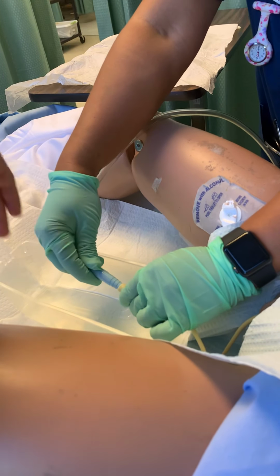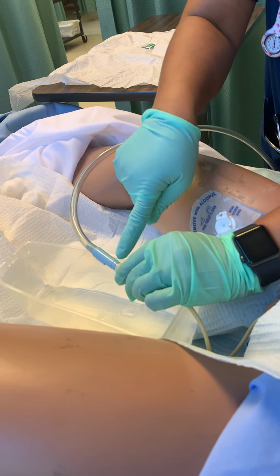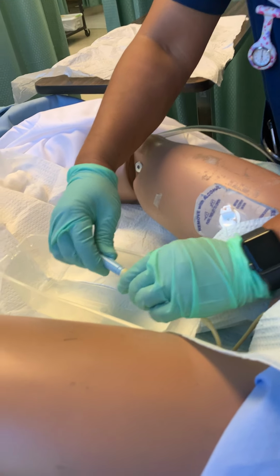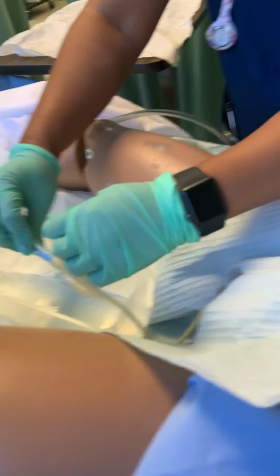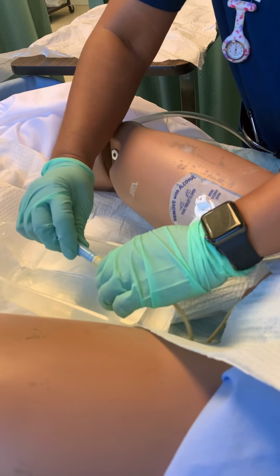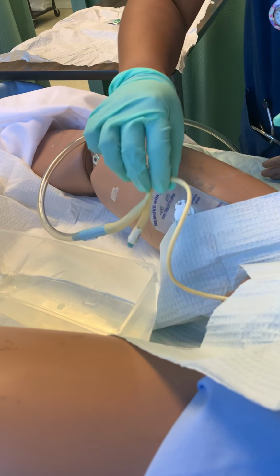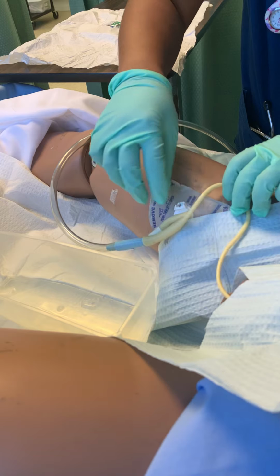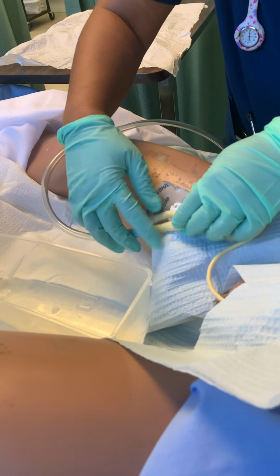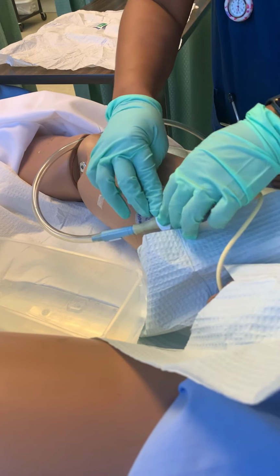Put it down because it's a urine bag. Yeah, that's good. It's easy. You know, next time if you pick this one, you're paying for this. Okay? Make sure to secure it really well, because when they poop or strain, it will just pop out. Now, for female, it's going to be letter C. And then put it here. For male, it's going to be letter S. Okay? It's not really working, guys.